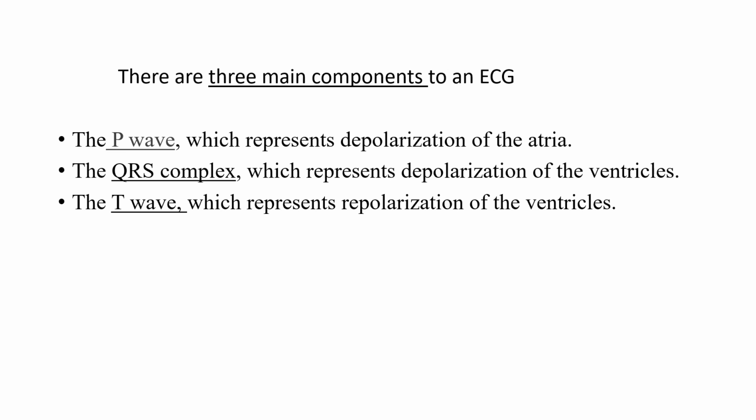Final one is T wave. T wave represents repolarization of the ventricle. What is repolarization of ventricle? Repolarization of ventricle means the recovery or relaxation of the ventricular muscle cell after they have contracted.